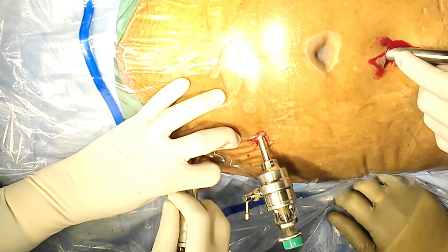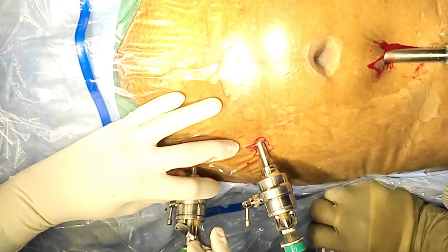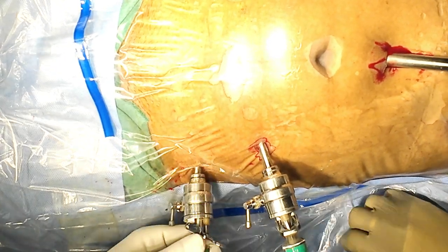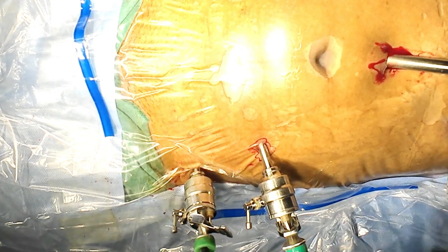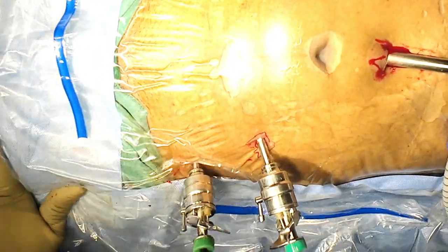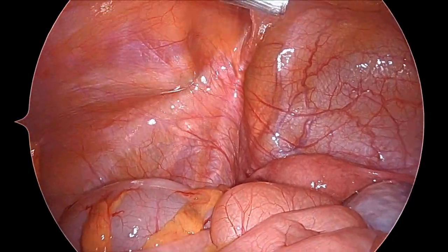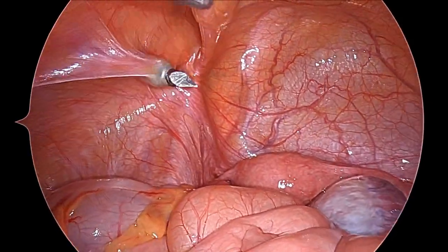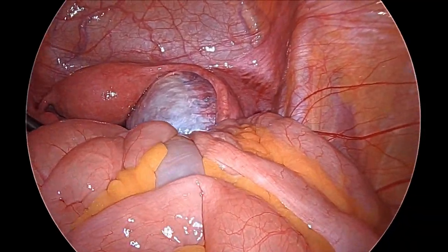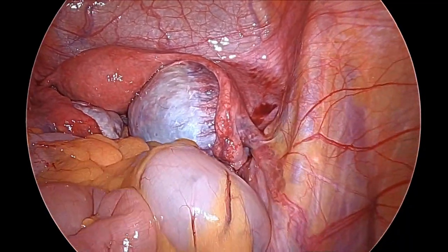All three ports are now introduced. Later we will put an additional port for the endobag. We will use the Ethicon Endo Catch here — all the bubbles need to be pushed up. This is the third port being introduced from inside, and all the small bowel will be pushed up above the sacral promontory.